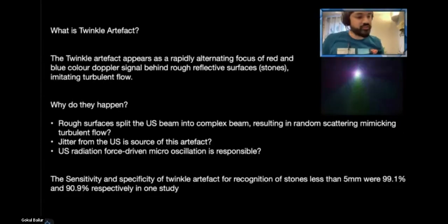But I think it's worth putting the color box on the bladder because, as well as the ureteric jets, which I tend not to actually worry about too much, but you can also, if there is a VUJ stone in the bladder, you'll often get a really nice twinkle artifact from that. And so then you know exactly, definitely that there is a stone in the VUJ, which is causing the problem. Yeah. How about anyone else in the audience? Or anybody else has a question on this case?